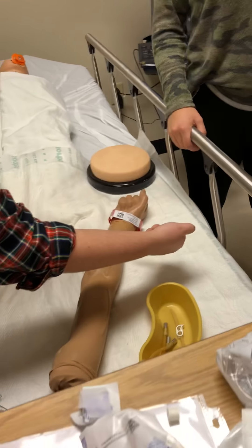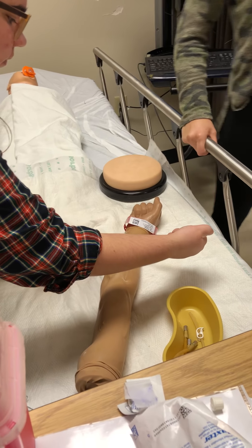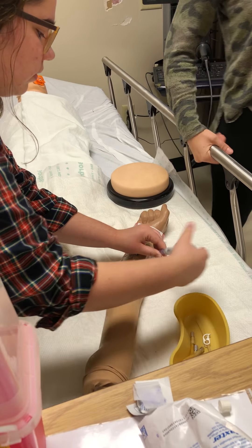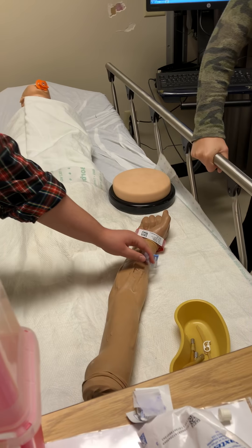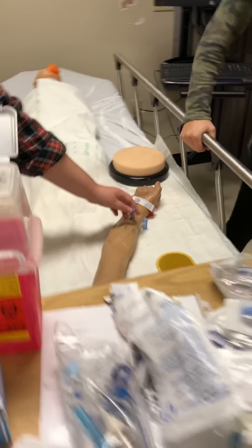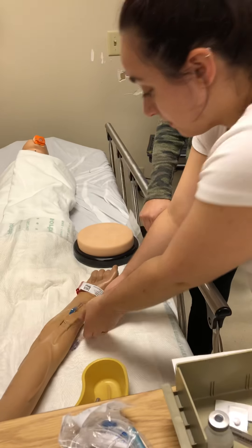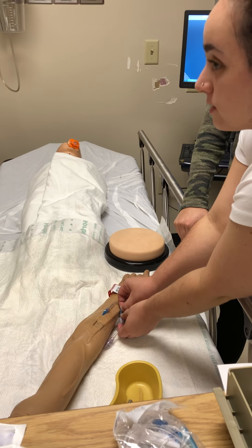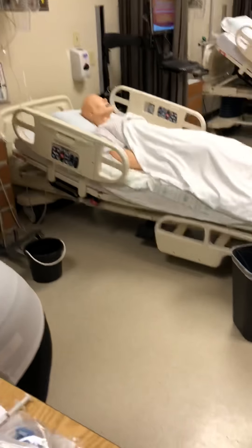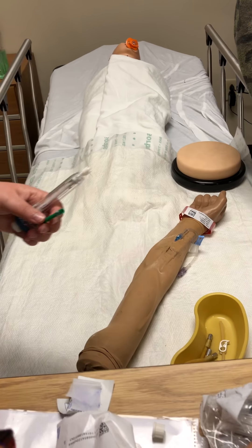But if there is medication left, then you have to bring it back to the medication room. There is a black box, you can put it there. But for the check-off, you don't need to do all that. So we're going to set the IV into the bucket too — it's just clamped. Just for if you get a sign now — because we have to clamp it. And then we have to clamp it.